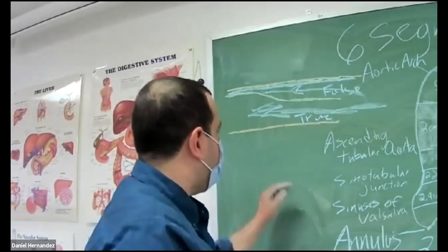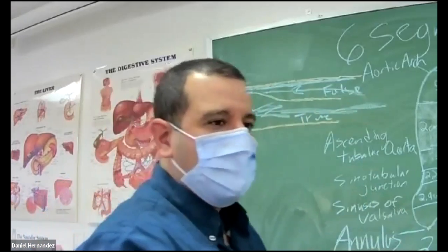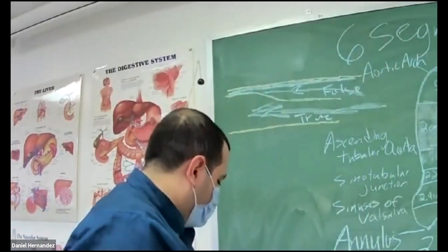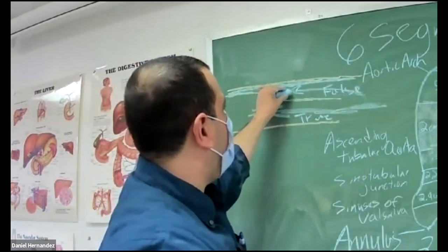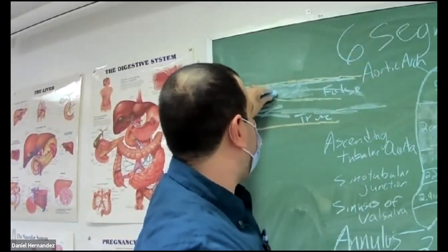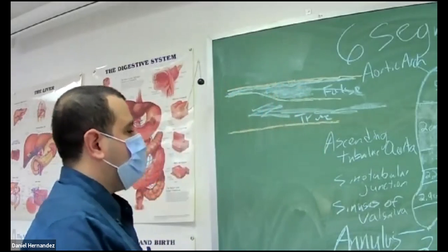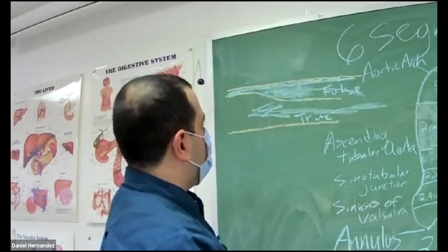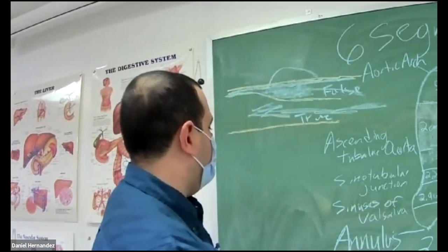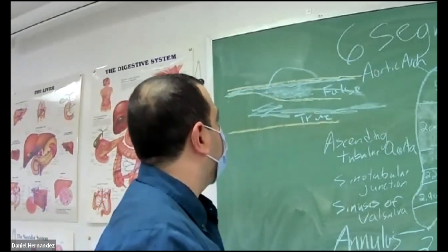And you could potentially see that intimal flap in the middle of the vessel, that bright echogenic line. But we can also wind up now with thrombus formation within that false lumen. So we can get stasis of blood in here, thrombus formation. And now you also run the risk of developing aneurysm too, along that area of dissection as well, because that vessel wall is weaker.